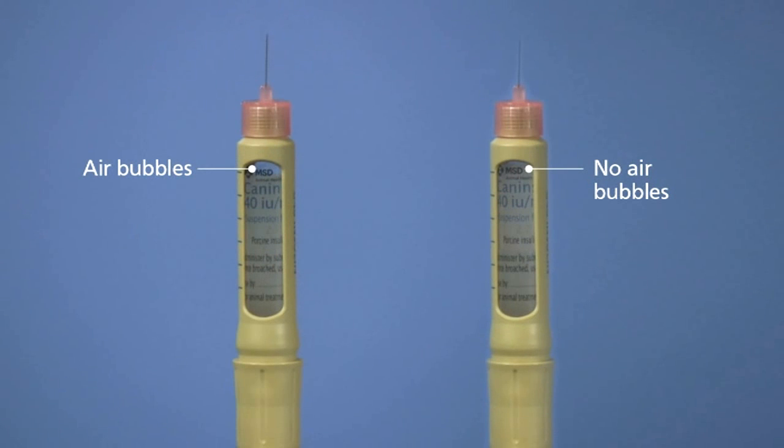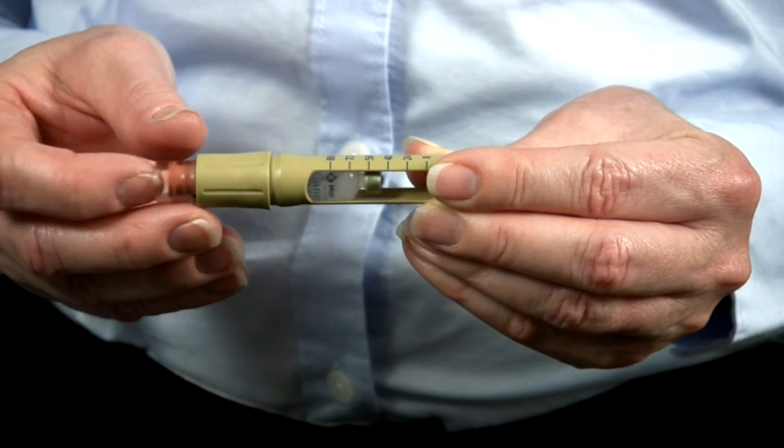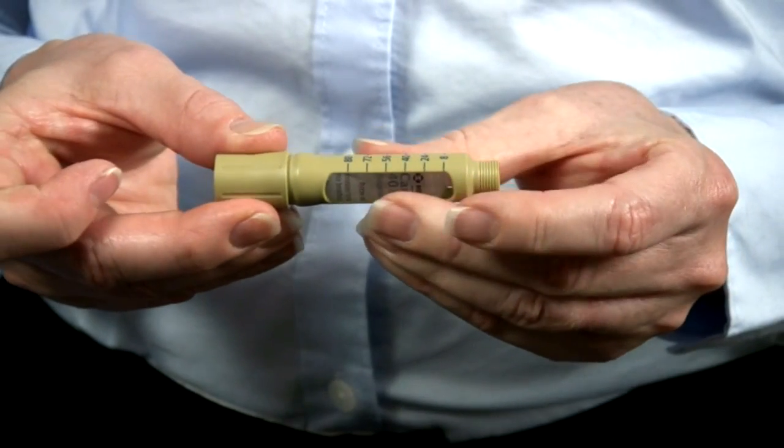When preparing for the next injection, you can skip the priming process as long as there are no air bubbles visible in the insulin cartridge. You should always prime VetPen whenever you insert a new insulin cartridge.